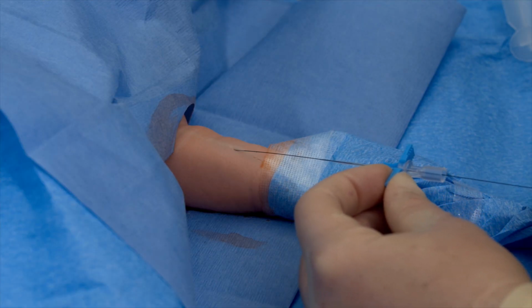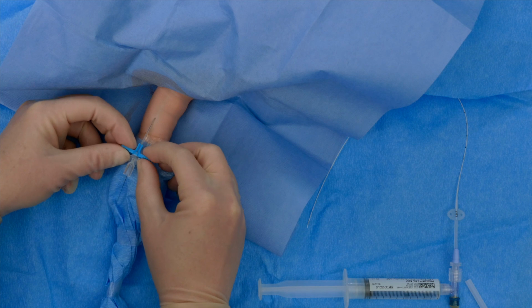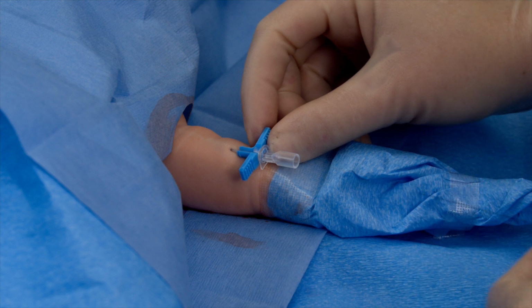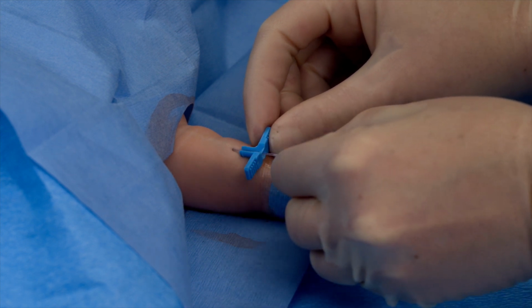Once the sheath dilator assembly is threaded onto the guide wire, it should be advanced into the insertion site and vein without much resistance. Though not common, if significant resistance is met at the insertion site and the dilator isn't advancing through the skin, a small skin nick may be necessary. With the sheath dilator assembly in place, remove the guide wire and dilator so just the sheath remains in the vessel.